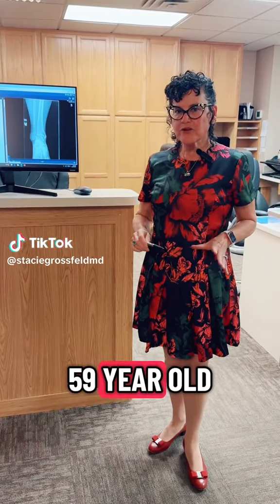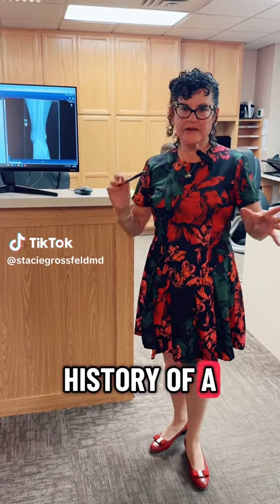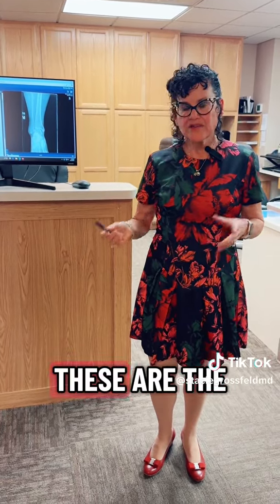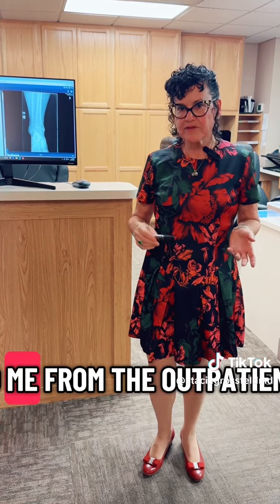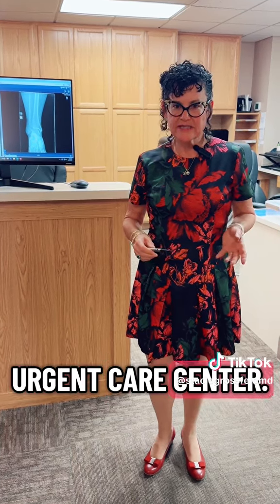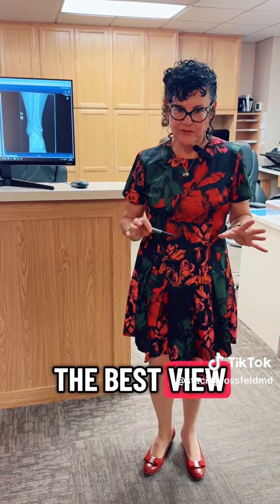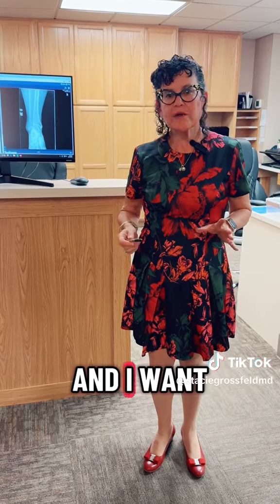I have a 59-year-old male with a history of a slip and fall that presented with a chief complaint of ankle pain. These are the x-rays that were sent to me from the outpatient urgent care center. I'm only going to show you one of the x-rays. This is actually the best view to review the pathology. And I want you to tell me what is the diagnosis and how you would treat this patient.